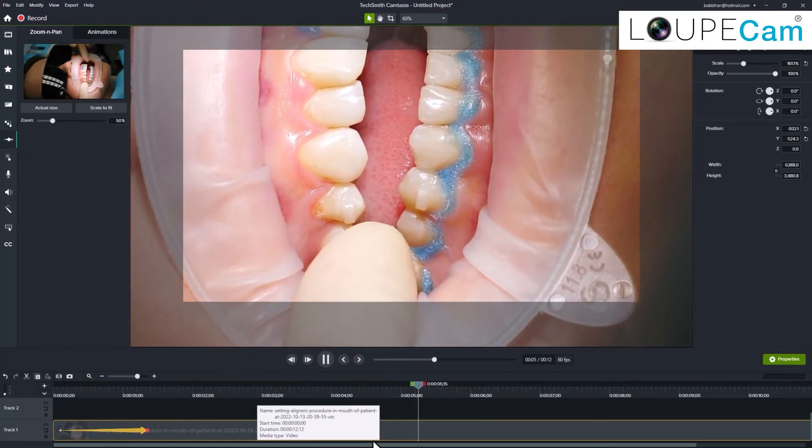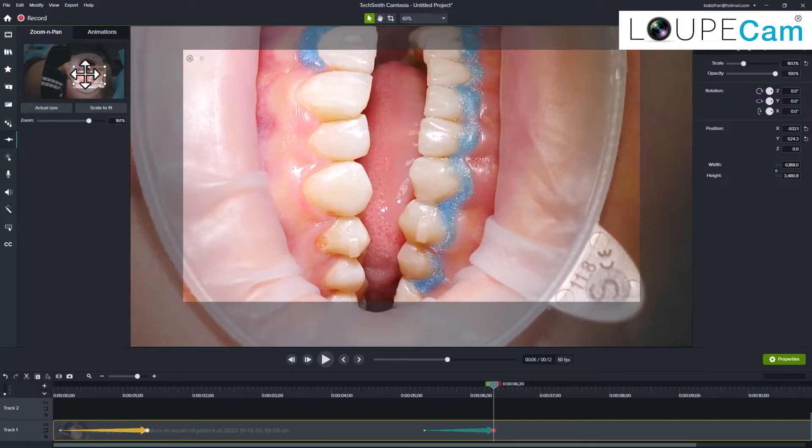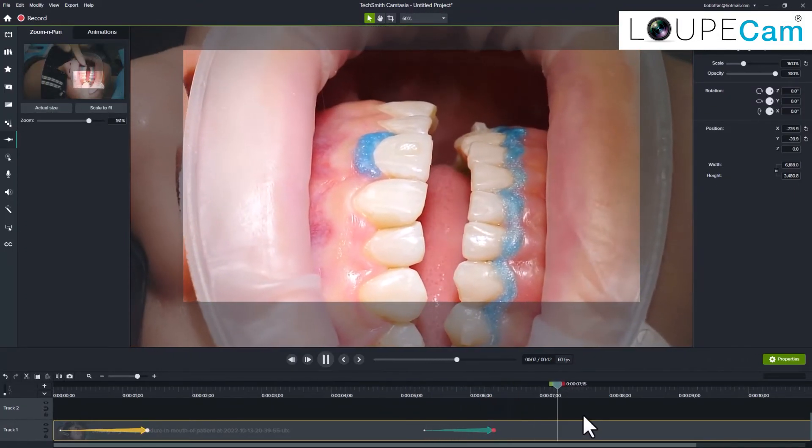When ready, I can zoom back out to the entire scene or even move to a different area. Remember, zooming in or out should enhance your video, not distract from it.